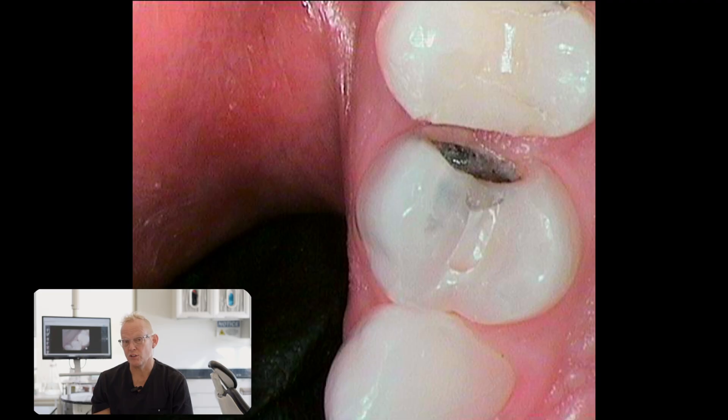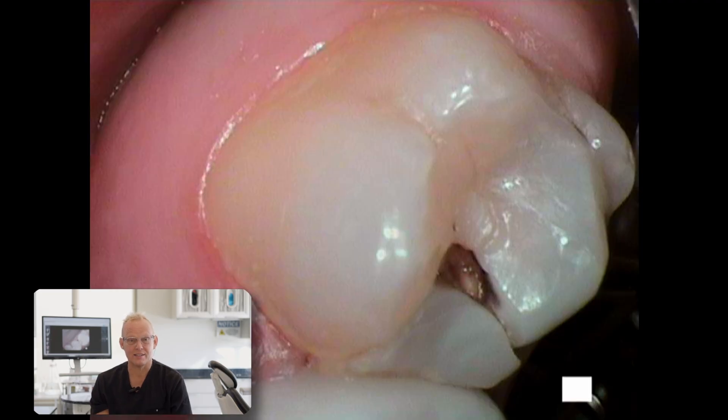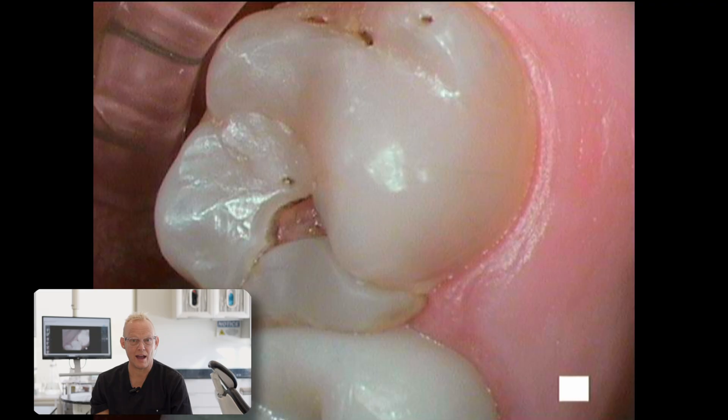This is Dr. Richard Anderson, your essential dentist. Today we're going to go over how I do a crown — a same-day crown — and can do it in under an hour. Today we're going to do three different crowns on the same patient within two hours. We're going to go over the entire procedure start to finish.